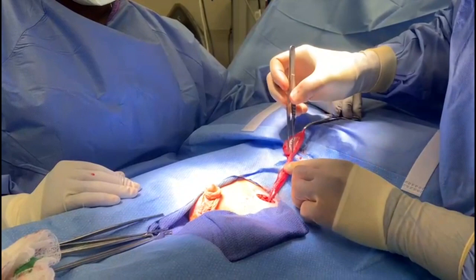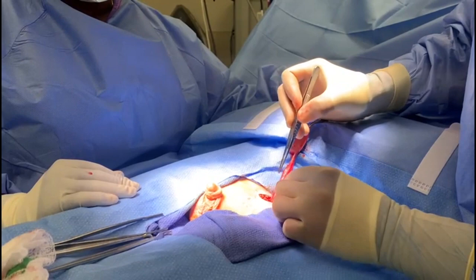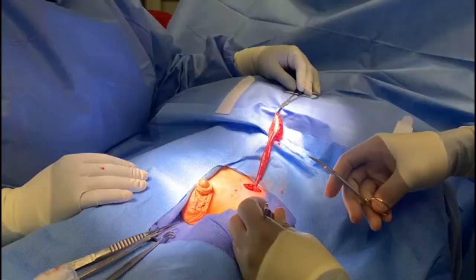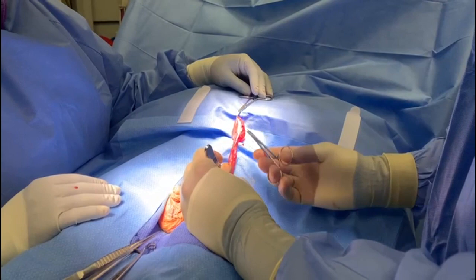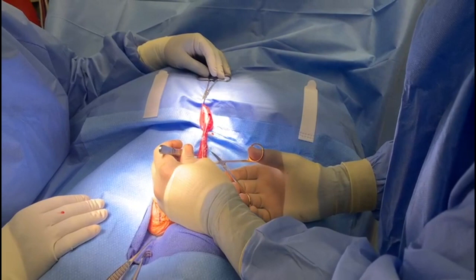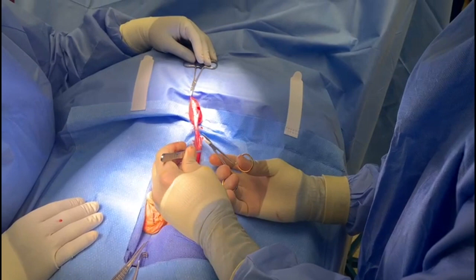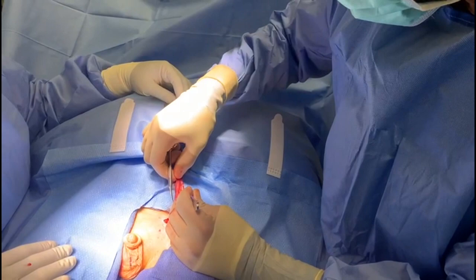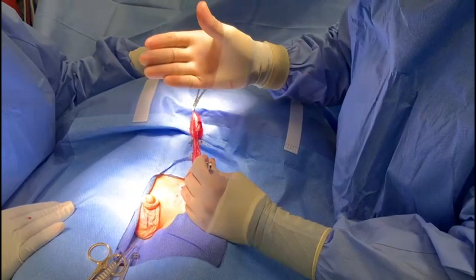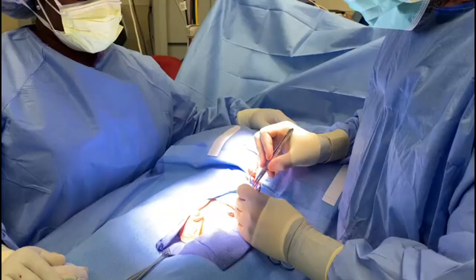So we're going to have to dissect this off. Typically I like to go through the external spermatic fascia all the way up here, but we may have to go posteriorly to unwrap it so we can get to the processus vaginalis and bring the hernia all the way down. We're going to go posteriorly, opening up the external spermatic fascia. I'm going to start proximally and slide this up to access the processus vaginalis without opening it inadvertently before we fix the hernia — opening it prematurely just makes it more leaky and difficult to find. We'll grab the cut edge, separate the cord structures, and then dissect the hernia down.